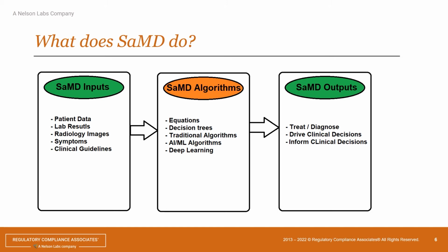It takes that information and applies some type of algorithm to transform it into something useful, that either treats, diagnoses, drives clinical management, or informs the clinicians to make those sorts of decisions. That's basically all that software as a medical device does.